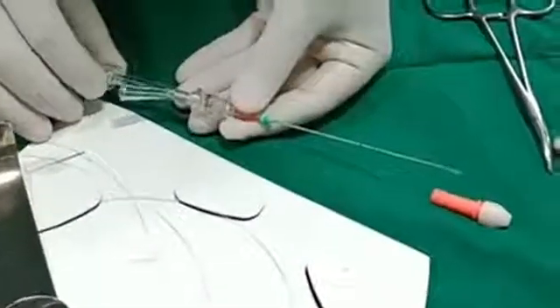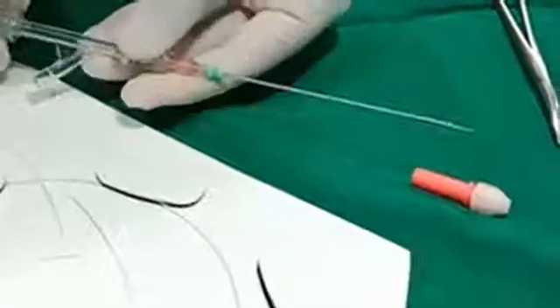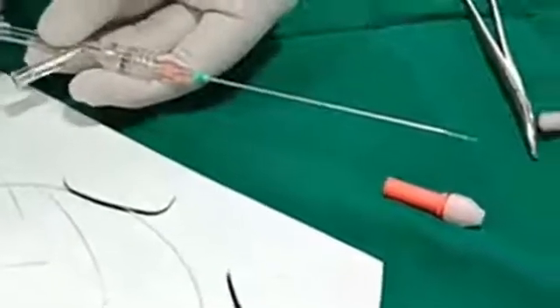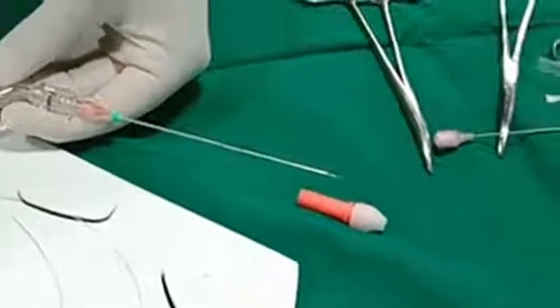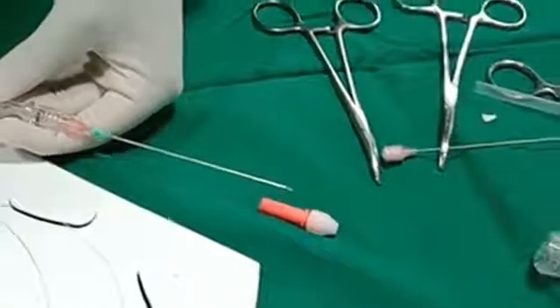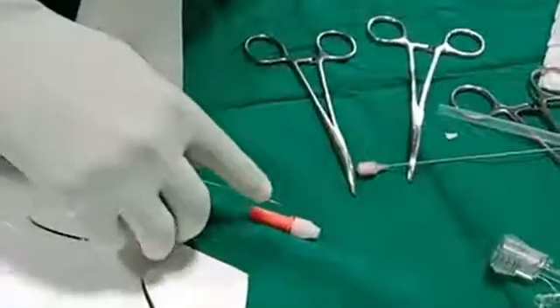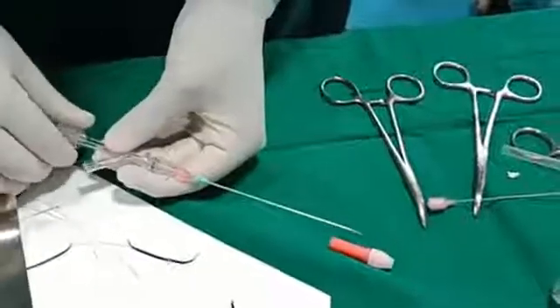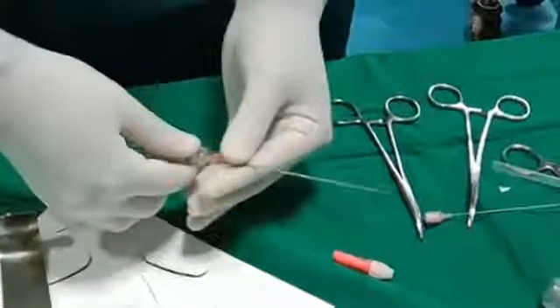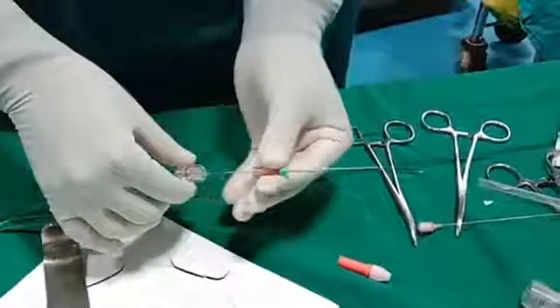After keeping it in the proper position, the laser fiber is locked with the Y connector. We can see here 3 to 4 mm the firing portion of the laser fiber is ahead of the needle tip. Now we will detach the needle and we'll start the procedure.